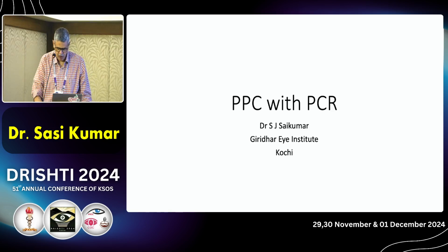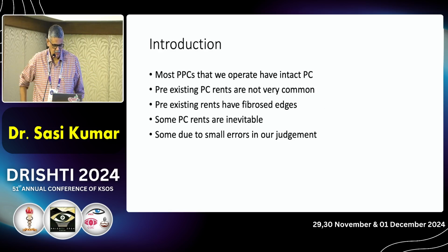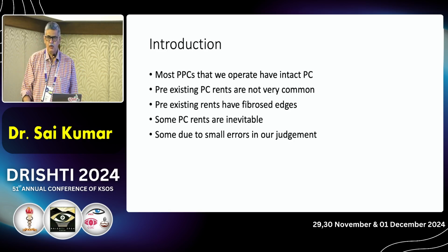The moment we hear about posterior polar cataract, your heart sinks. You are wondering what to do, whether you'll have a drop, whether you have to have a backup. So these are the thoughts that go through your mind. So I have been given the topic of posterior polar with PCR. I am showing only PCR videos, not the normal videos. But just a few points of introduction.